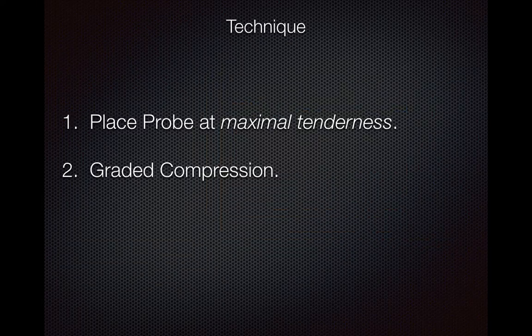For the technique, first you place the probe at maximal tenderness and you do a graded compression technique just to get the bowel gas out of the way and maximize your images.